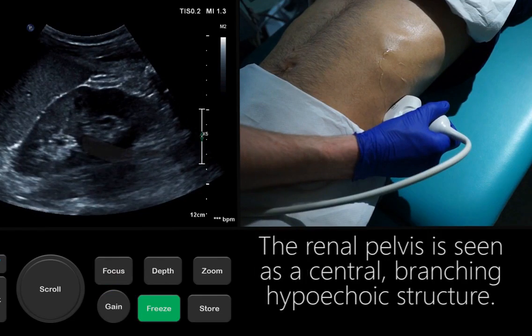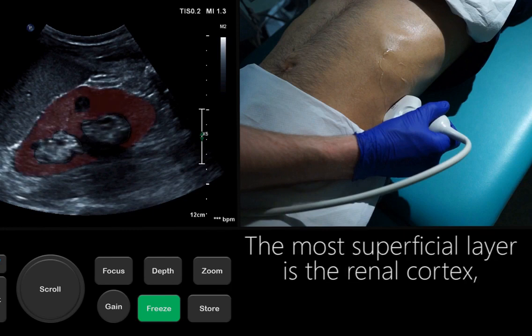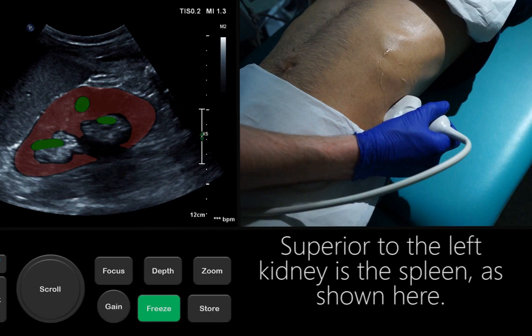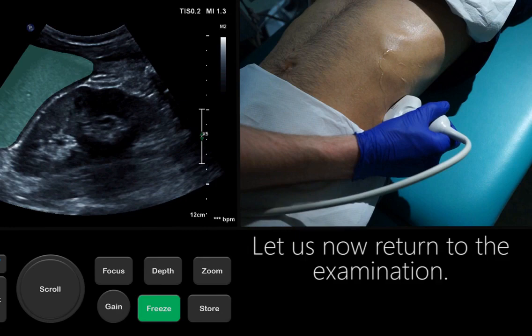The renal pelvis is seen as a central, branching hypoechoic structure. The echogenic sinus fat can be seen centrally. The most superficial layer is the renal cortex, within which the medullary pyramids are seen. Superior to the left kidney is the spleen, as shown here. Let us now return to the examination.